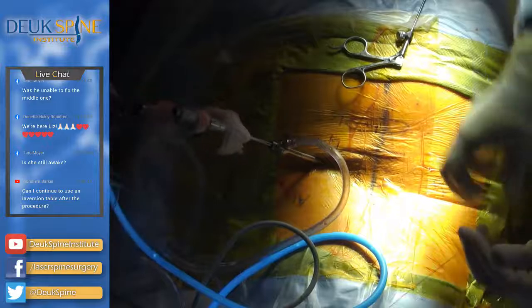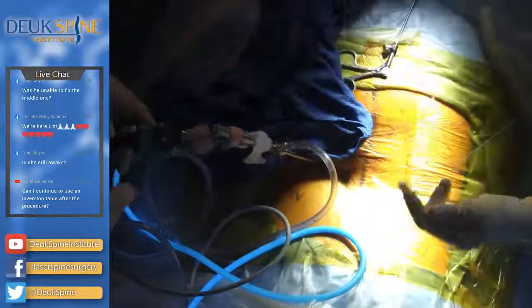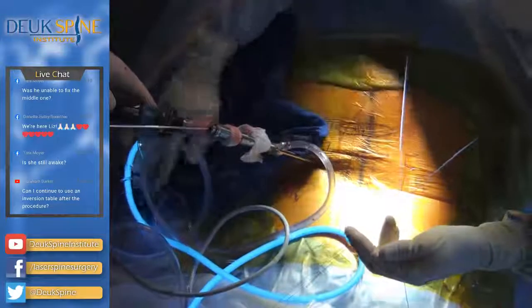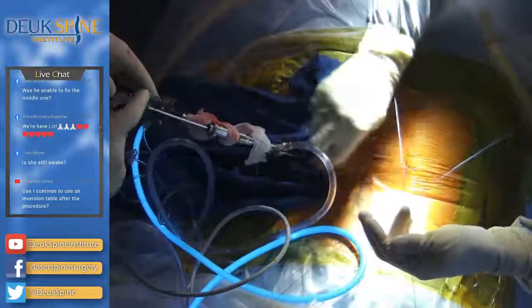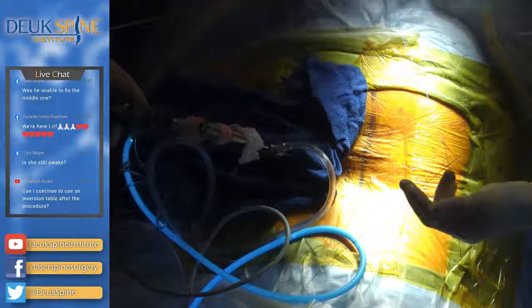All right. There it is. We'll be done in 10 minutes, doctor. This is all herniated disc material.